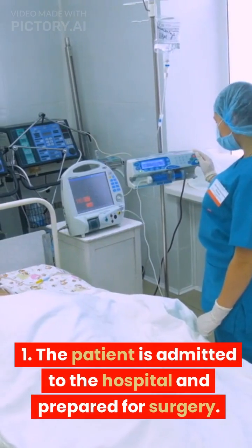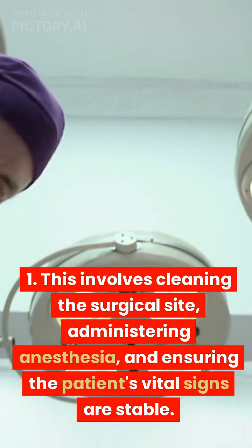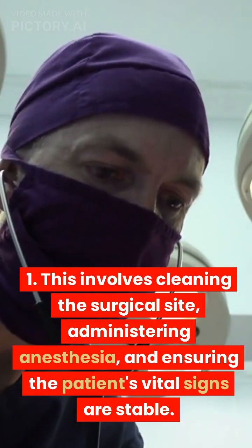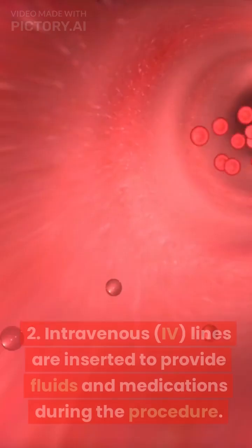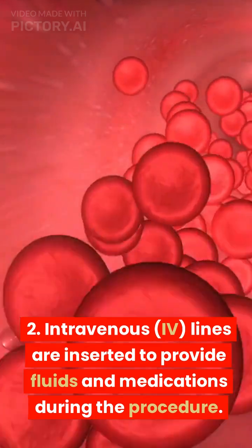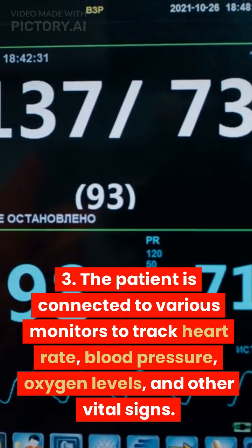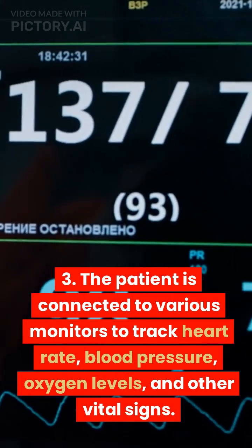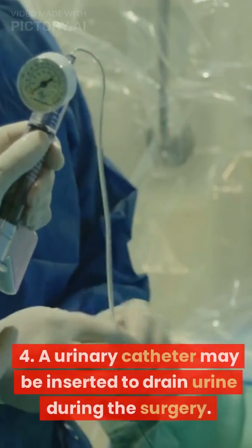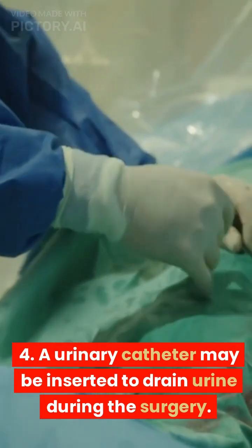Preoperative preparation. 1. The patient is admitted to the hospital and prepared for surgery. This involves cleaning the surgical site, administering anesthesia, and ensuring the patient's vital signs are stable. 2. Intravenous, IV, lines are inserted to provide fluids and medications during the procedure. 3. The patient is connected to various monitors to track heart rate, blood pressure, oxygen levels, and other vital signs. 4. A urinary catheter may be inserted to drain urine during the surgery.